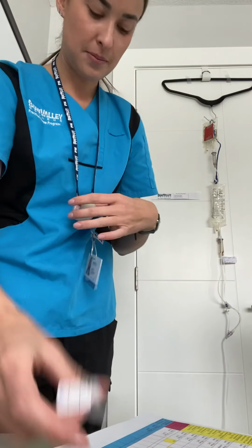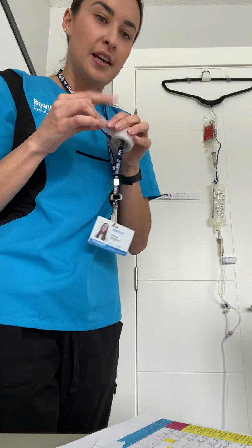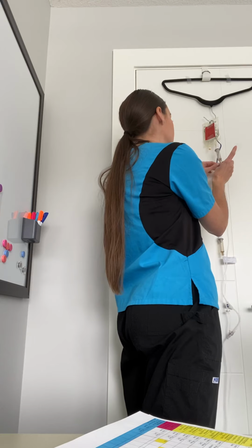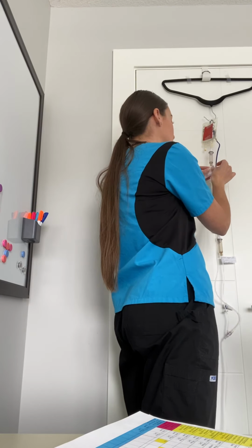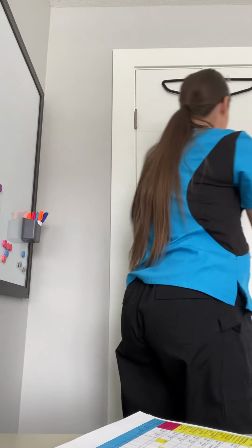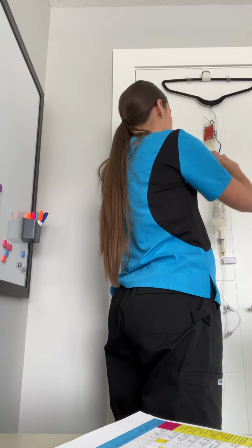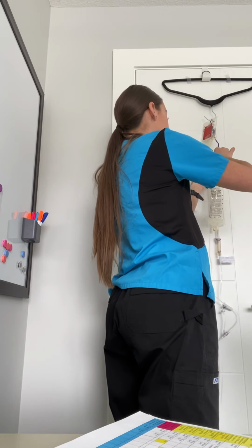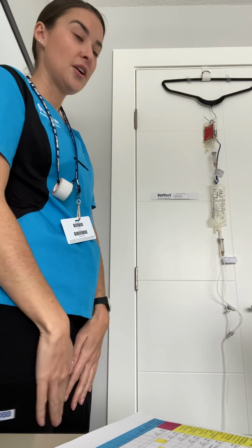Before I leave the room, I'm just going to apply the secondary line label here as well. Again with tape because I don't have adhesive, and we just want to do it under the chamber here. Oh gosh, hopefully this is tight enough. Oops. Excuse me. Oh, maybe the right direction would be good. There we are. So Allison, I just want to clarify we're good on the teachings and you understand any signs of infection and everything. Okay, perfect.